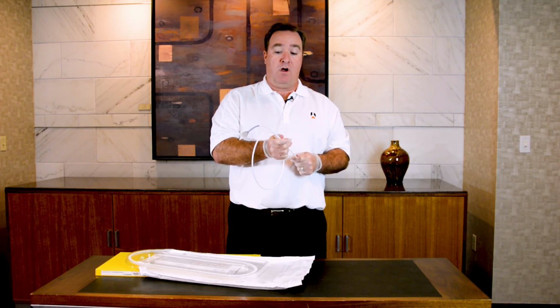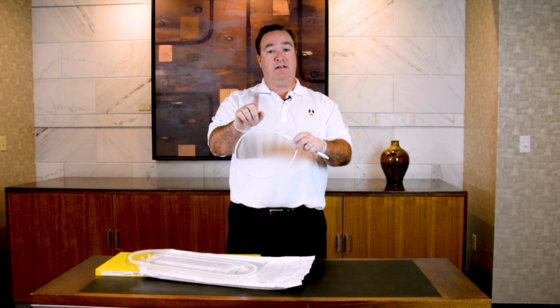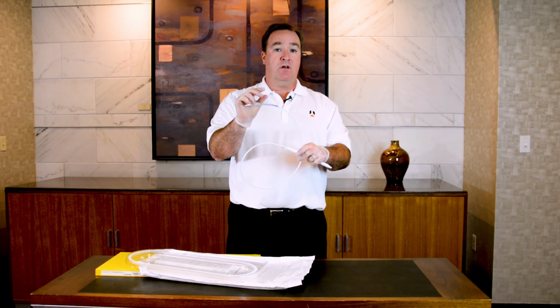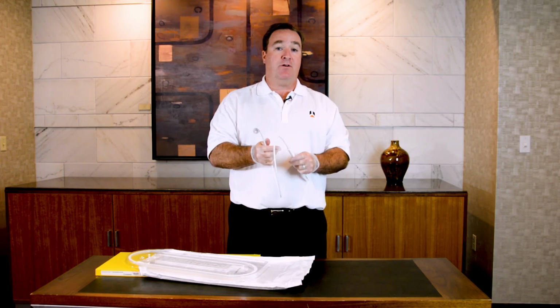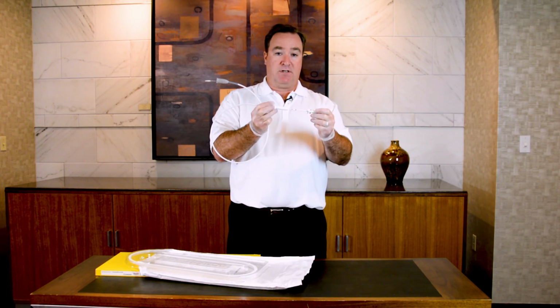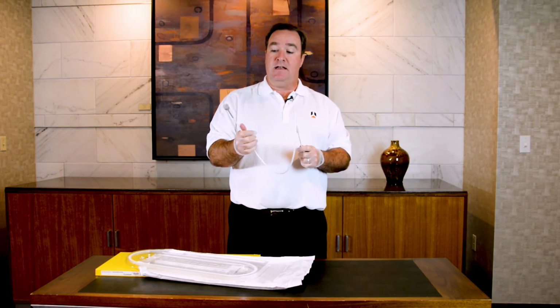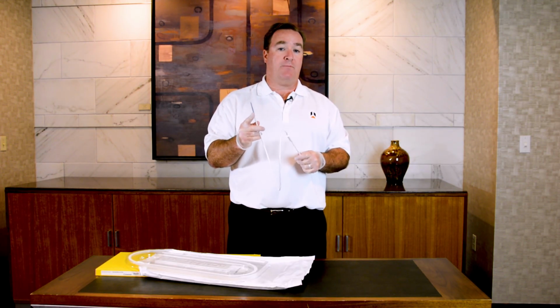Again, once you start deploying, the stent, because it is a coaxial delivery system, does have a tendency to move forward as it's deployed. You'll have to keep the proximal marker aligned with your external proximal marker, so you may have to pull back on the catheter to do that. And you'll watch the stent deploy. Again, up to 70%, you can recapture the stent if you're not happy with where it's deploying. Really the key is to focus on the proximal fluoroscopic marker. That is the most accurate. That is where the proximal end of the stent will end up during deployment.